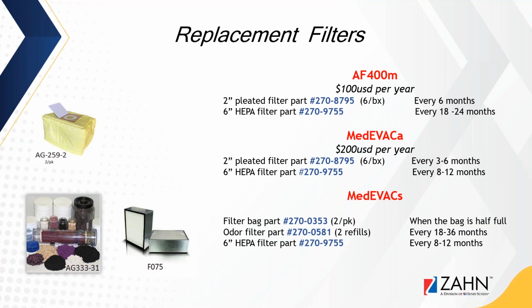We were also asked about cleaning and disinfecting the mobile arms on the Medivac systems. And the best solution there is actually soap and water. The reason why people are telling you to wash your hands as often as they are is because the virus, specifically CoV2 virus, is made up of a protein and something called RNA, and those are the building blocks of the virus. And there's a protective membrane of fatty tissue that surrounds those proteins, and the best way to break down that membrane is actually soap and water. But a high content alcohol disinfectant on the nozzle between patients certainly will work fine.